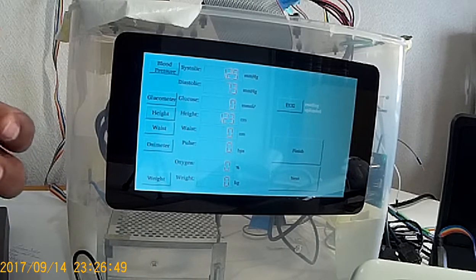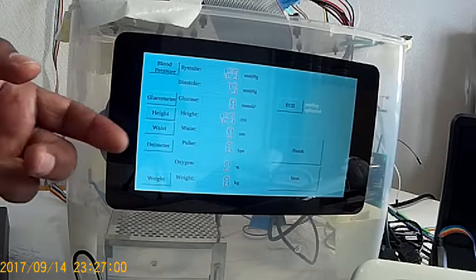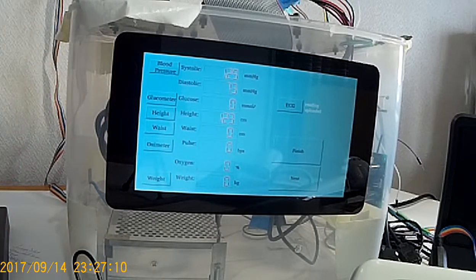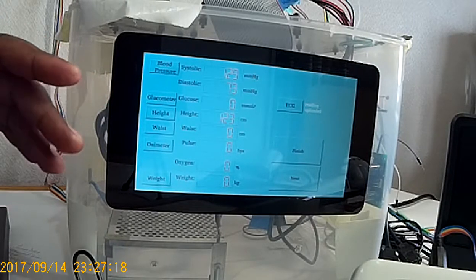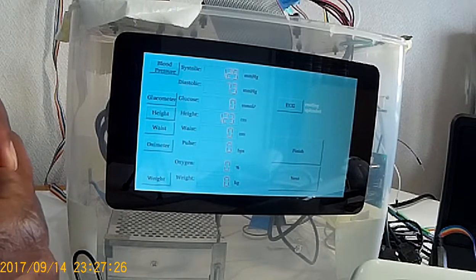It can be personal, but these things help improve our health by building awareness of how body fat can really affect our health in the long run. And height measurement is used in the BMI calculation, the body mass index calculation. So we're going to use the height, waist and weight measurements towards BMI calculation.